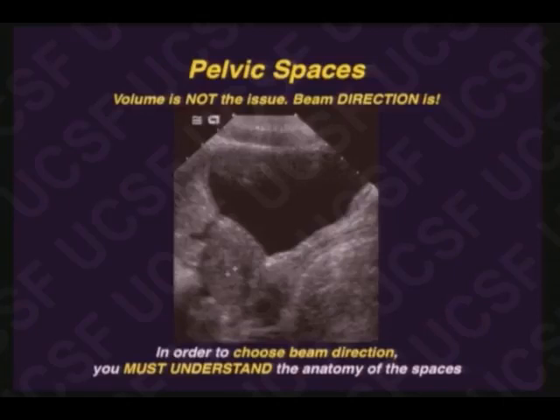Indeed, I don't have to tell you. Every day you make a decision about whether you are or you are not going to call fluid that you find in the cul-de-sac of a female patient. No, we would all call that a normal amount of fluid. It's not pathologic.